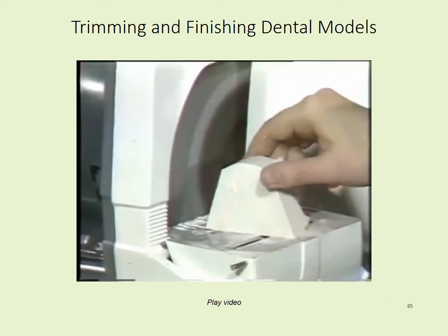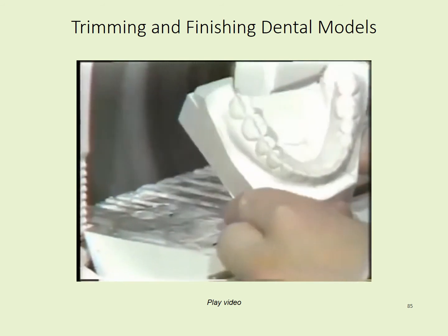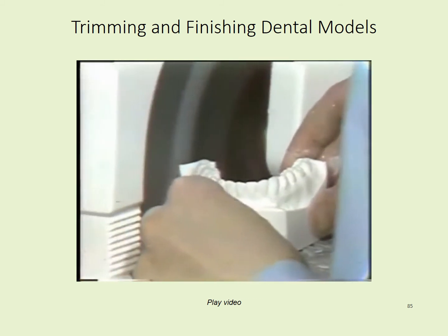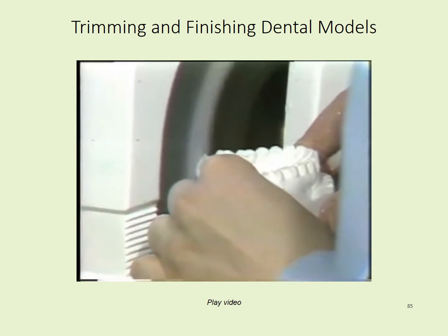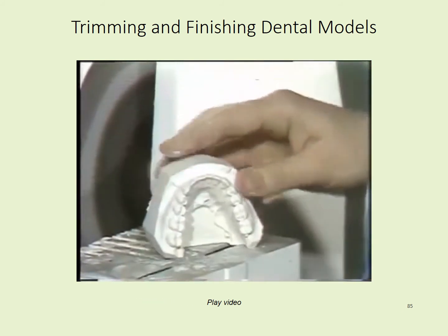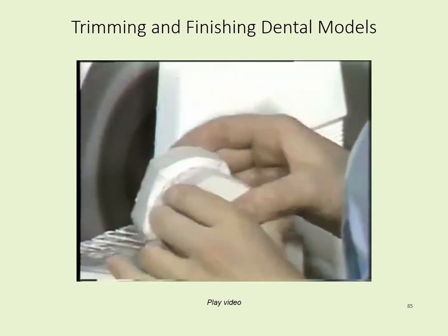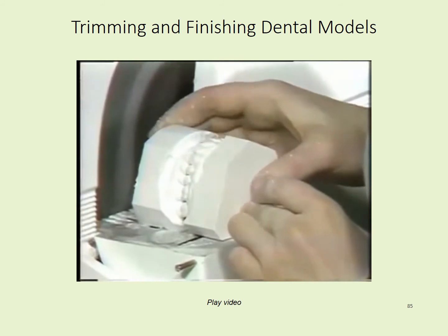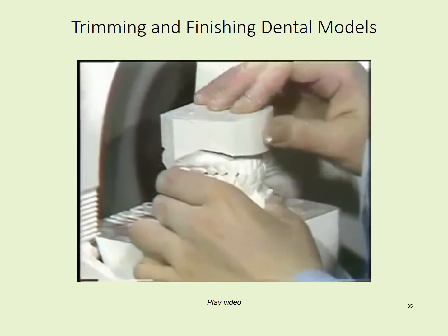After the arc is trimmed, you should trim the heels. Unlike the maxillary cast, the mandibular heels should be trimmed so that they are parallel to the opposite side. When the mandibular cast is trimmed down, you should relate it to the maxillary cast, resting the cast on the back. If the backs are not perfectly equal, you may have to trim a little bit more to even them up.